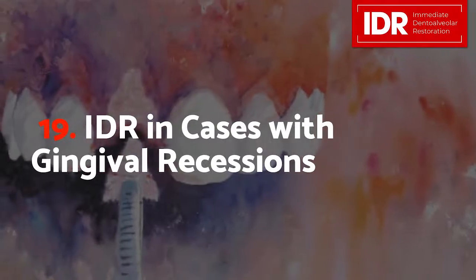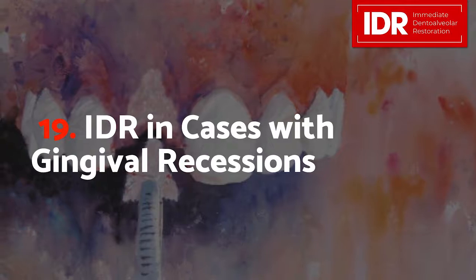Module 19, IDR in cases with gingival recession. Now it's time to focus on cases that presented gingival recession, slight or large. Our target here is to restore hard and soft tissue damage using, in most of the cases, triple graft harvested from the maxillary tuberosity. This is our main indication to treat cases with bone loss and gingival recession.